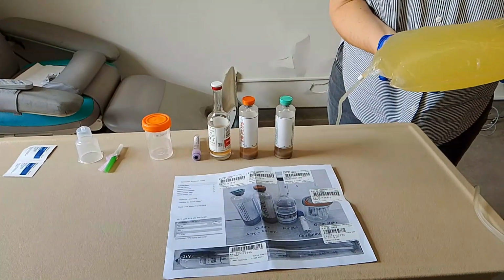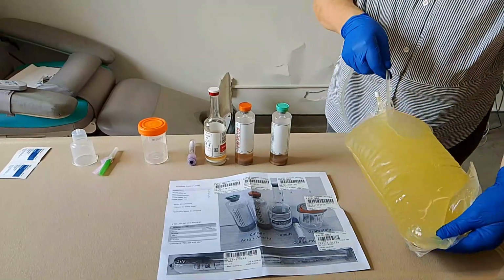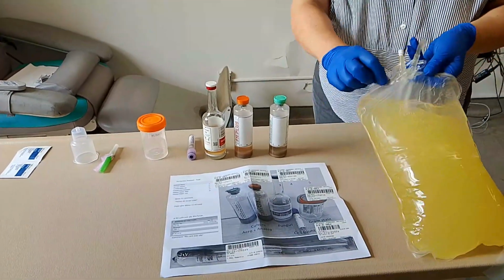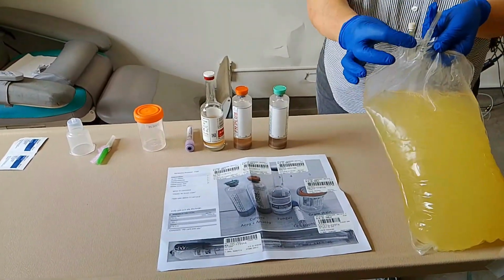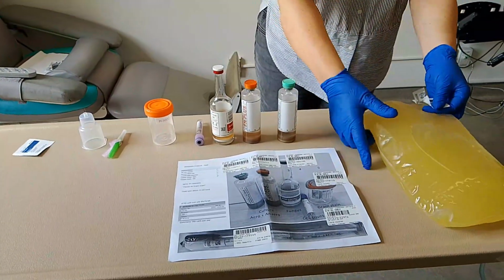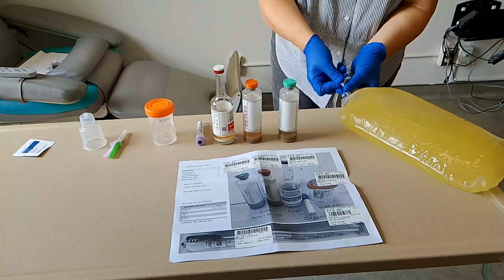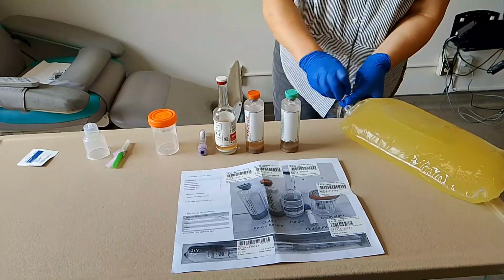Once you have your peritoneal fluid that was drained and that has been in the abdomen for at least 2 hours, proceed with taking samples. As per order on the chart, green. Of course, disinfect your port with alcohol.